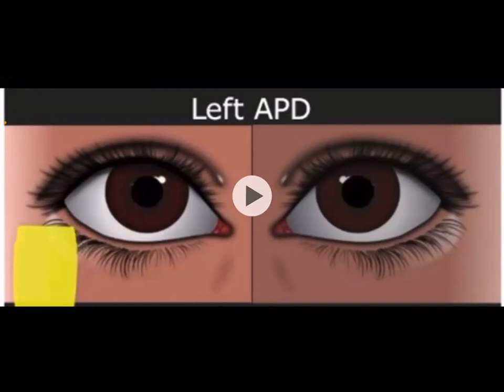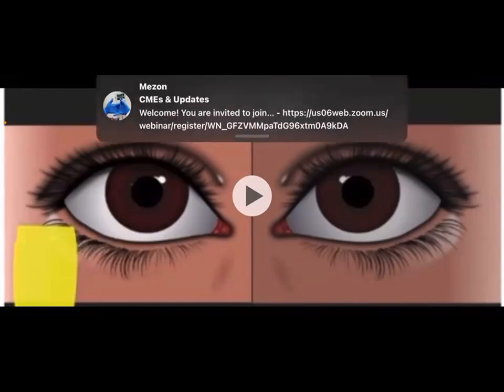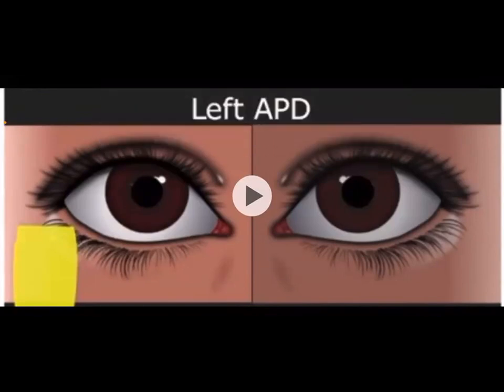It will be very difficult to focus. Okay. You can just take permission from the patient by telling him, is it okay if I put my hand on your shoulder? He will tell you yes. Then you can proceed with examination. So permission for examination, permission to dim the light, instruction for the patient to keep looking at the distance, because when the patient looks at a far object, the pupil will dilate. Okay, so it's really important to tell the patient to choose a spot on the wall and keep looking at it. So how will you take the permission and give the instruction?